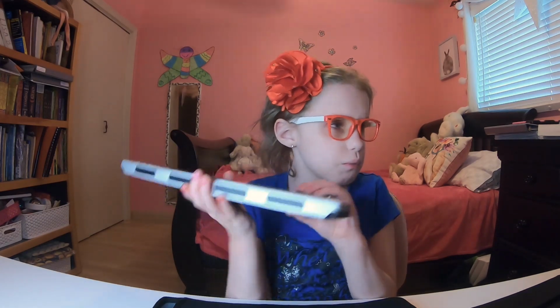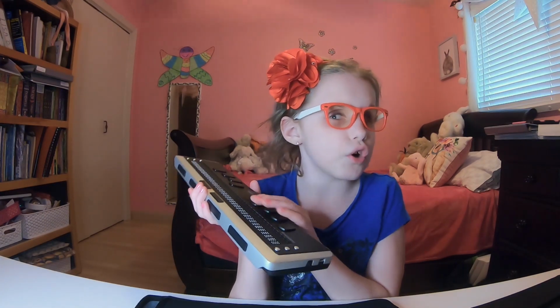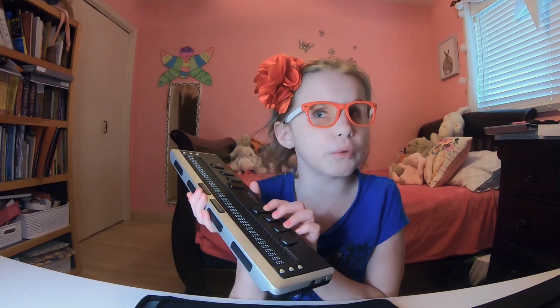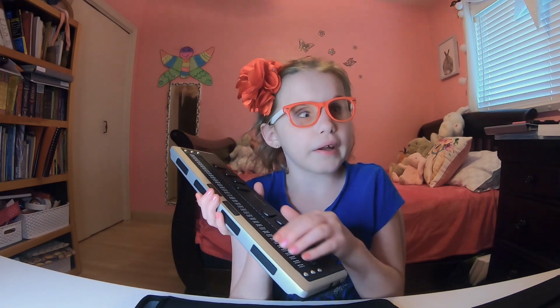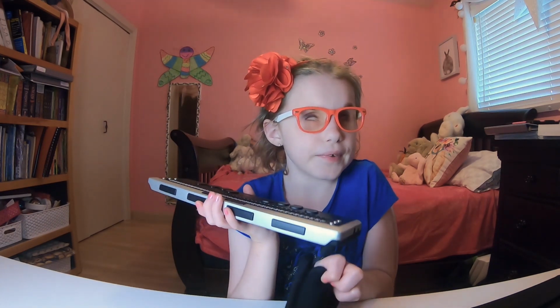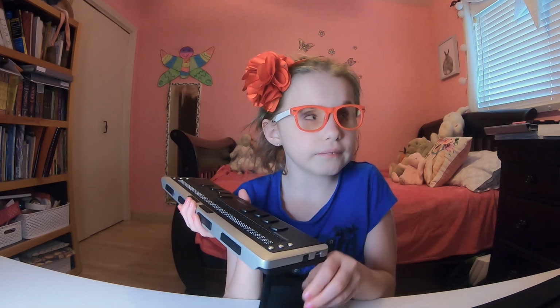Let me just point out one difference. The BrailleNote Touch is its own computer. It's its own piece of technology. As with the braille display, you have to hook it up to your iPad, iPhone, whatever you want to hook it up to. You just hook up the braille display. It does nothing on its own, but you have to hook it up to an iPhone, iPad, tablet, whatever you have, you can hook it up. So that's a really cool thing.